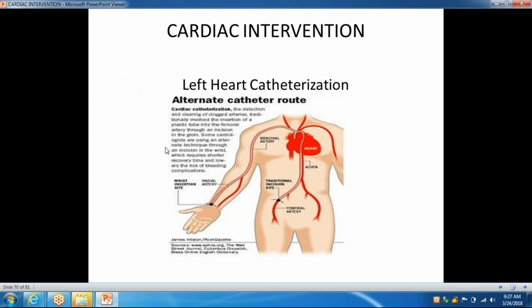So if we go through the wrist, we cannulate the radial artery, and then our catheter will travel through that vessel straight up, and we would enter the right subclavian, then the right subclavian would enter the aorta, and you want to position your catheter this way, and we'll show you in more detail.